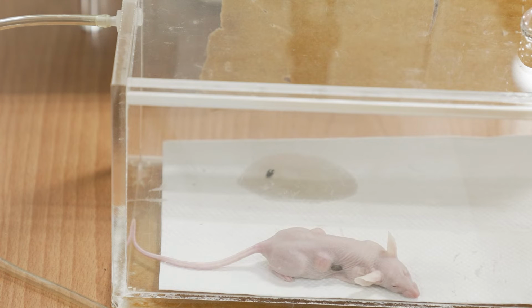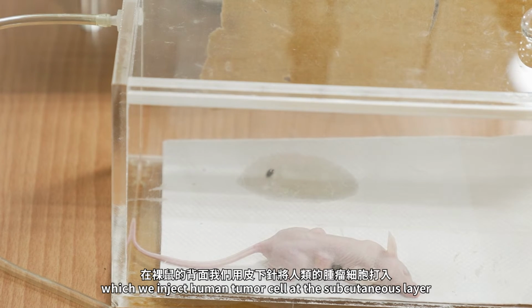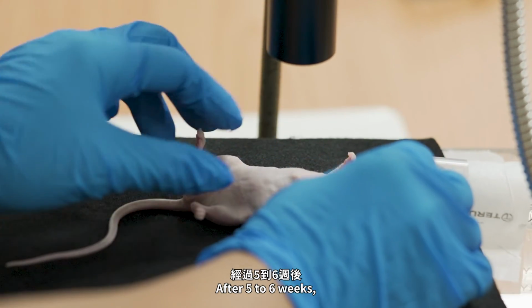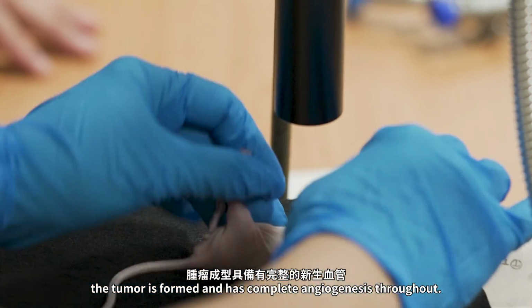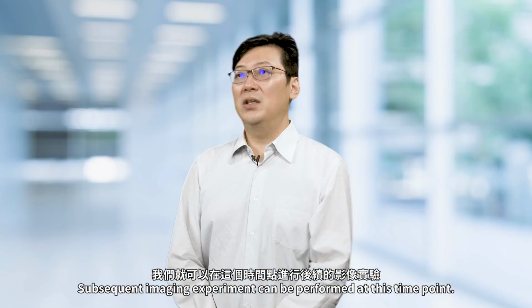In our experiment, we used immunodeficient nude mice, into which we injected tumor cells in the subcutaneous layer of the back. After 5 to 6 weeks, the tumor is formed and has complete angiogenesis throughout. Subsequent imaging experiments can be performed at this time point.